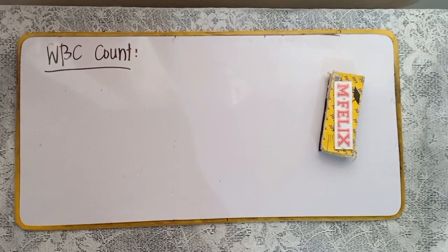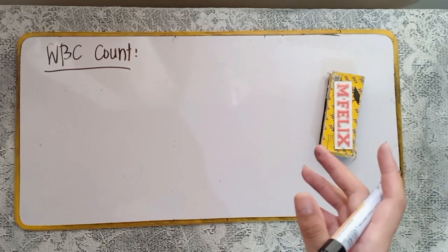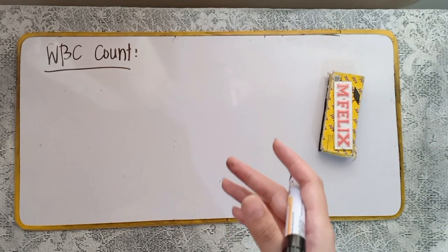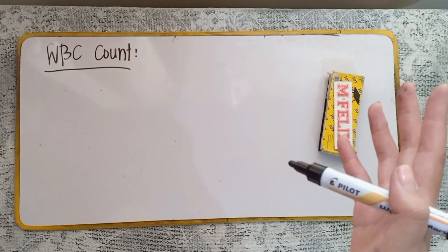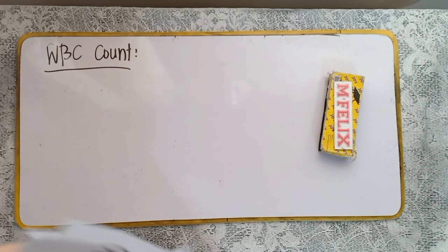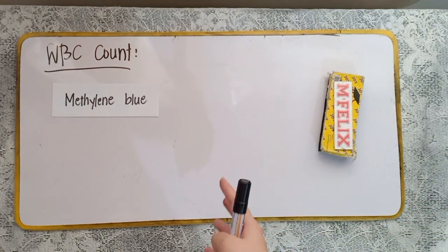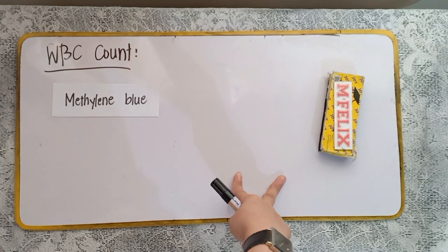Now, let us discuss the WBC count first. Lysis of RBCs muna, class, must be obtained prior to performing the WBC count on either a diluted or undiluted specimen. Specimens requiring dilution can be diluted in the manner described previously. Substituting 3% glacial acetic acid to lyse the RBCs. Addition class, pwede tayo maglagay ng methylene blue to the diluting fluid to stain the WBCs, of course providing us better differentiation between neutrophils and mononuclear cells.